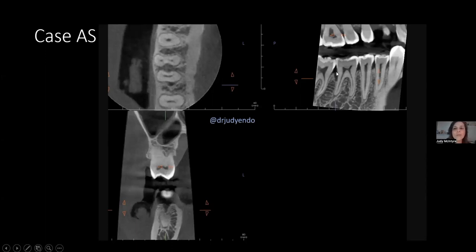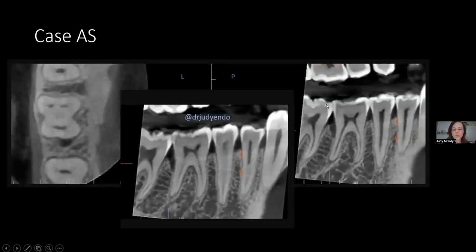And if you were to probe, right? I know probing seems difficult and it can be, especially interproximally, but if you angle this, you're going to get a reading. You're going to get the 7mm reading here. And this we're not saving.